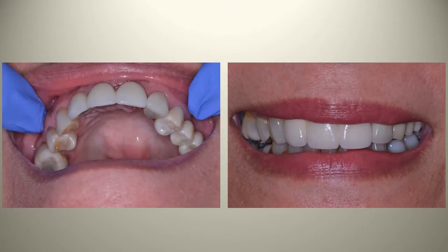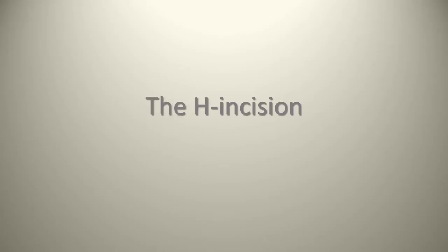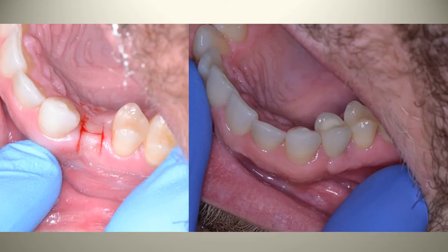And then in lecture 8, we talked about a few things. We talked about the H incision for patients versus using a tissue punch or a circular incision. The main reason we had described this was different ways of accessing your patient or your implant after placement. And the major difference of the H incision versus a circular incision or use of a tissue punch is you're keeping a lot of keratinized tissue in the area, and you're also beefing up the soft tissue biotype by beefing up the amount of mucosal tissue, the connective tissue that sits in and around the implant.